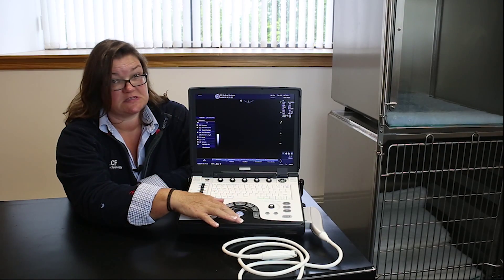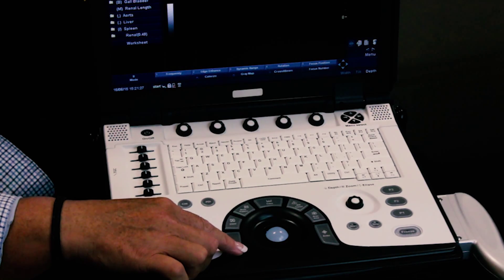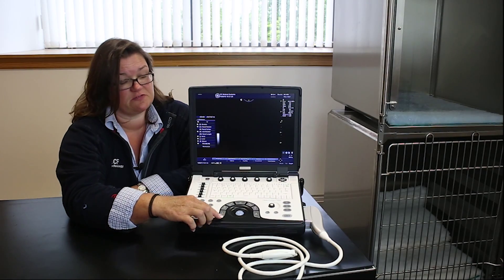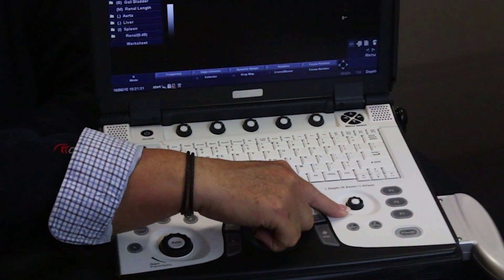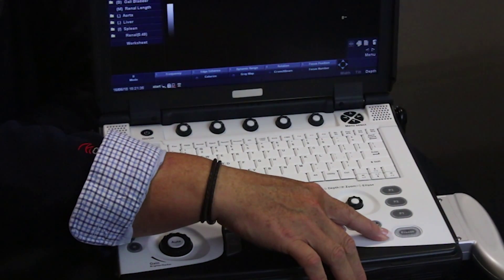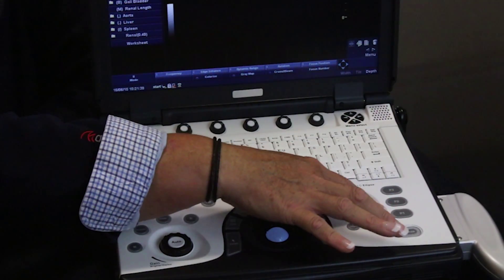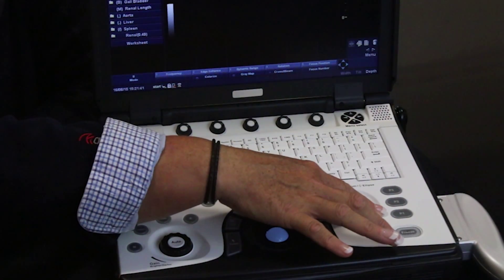The trackball is in the centre at the bottom, with various trackball functions around the edge, and then another important key to the right of that is the depth key. The freeze key is at the bottom right-hand side, just below three programmable buttons, which we'll be using mainly for printing and storing functions.